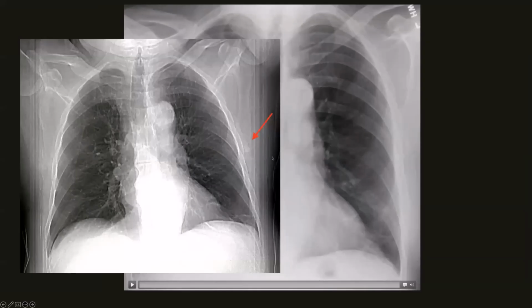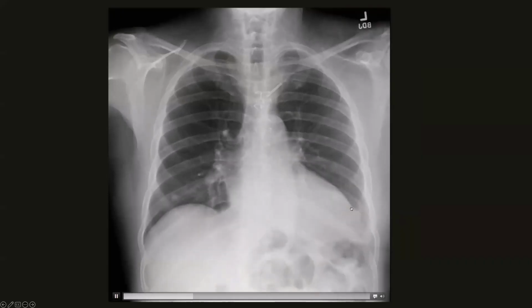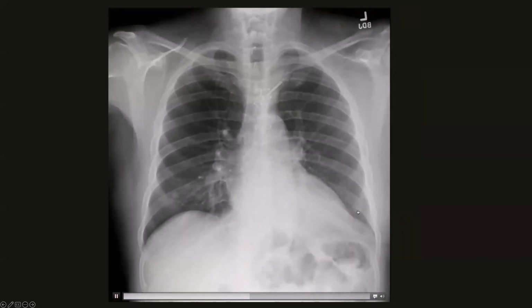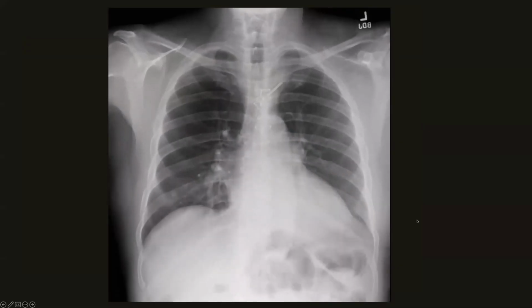This patient had a subsequent CT for a different indication, and you can see that this nodular opacity moved out more laterally as the patient lifted their arms above their head for the CT scan. So this was indeed a nipple shadow. And this is just another example showing these symmetric nodular opacities in the bilateral lung bases, which remained relatively fixed to the chest wall, compatible with nipple shadows.